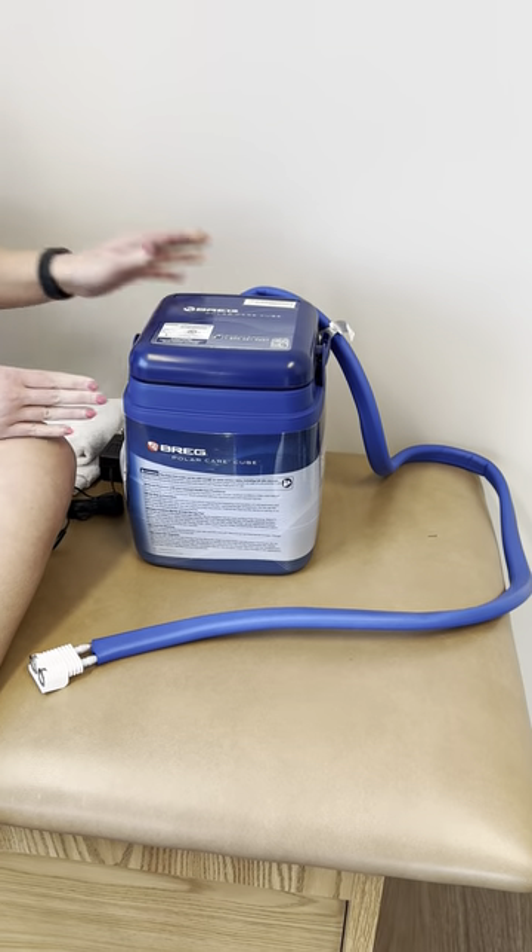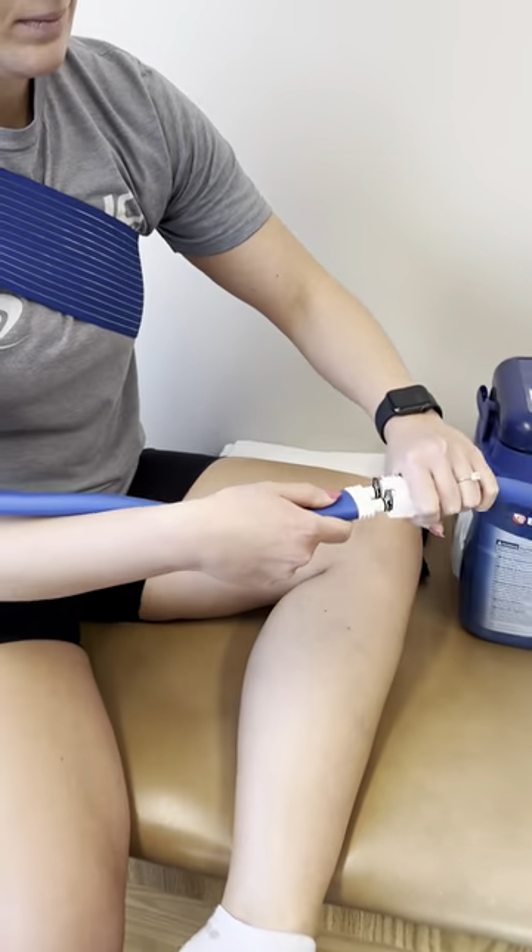You will then take the tubing and connect it to the bottom of your pad. This will just snap in.